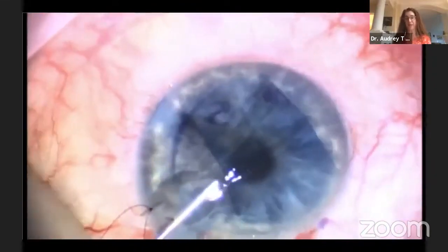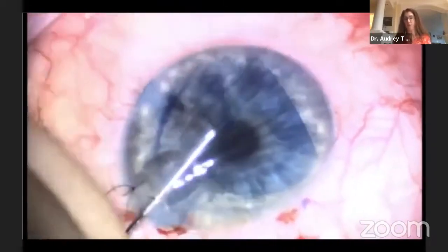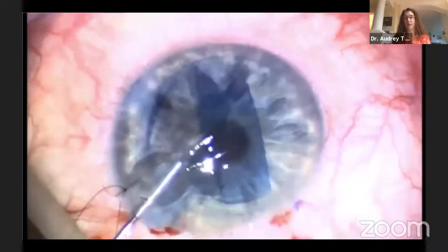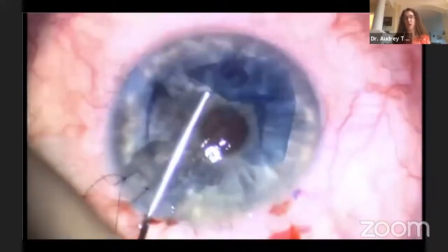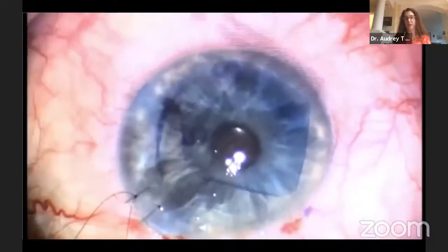And there you can see that's why you have the orientation mark. Not a problem. You can go back and just do short bursts of fluid there. So you can see short bursts of fluid, and eventually you can get that to cooperate. Sometimes it takes a little bit, just short bursts of fluid. And be sure you're not touching the tissue with the cannula.